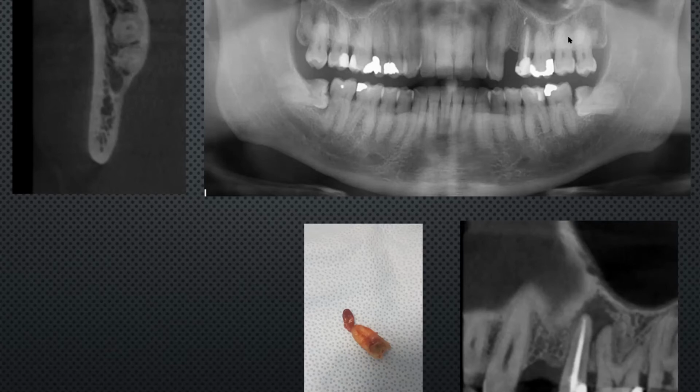Okay, that's a really good overview. So for the purposes of the audience listening, let's assume this case has come back. Now you've taken the 5 out. The block graft has kind of healed. So now you're looking at a patient coming in with an edentulous 24, 25 site with good bone, because most of the listeners aren't going to be doing block grafts. So the patient comes back now, 2-3 months later, everything's kind of healed up. Let's talk about maybe your flap design and what the surgery was then from start to finish in the placement of the implants.